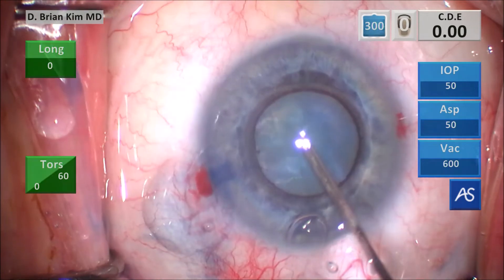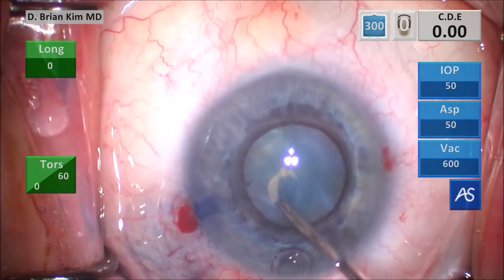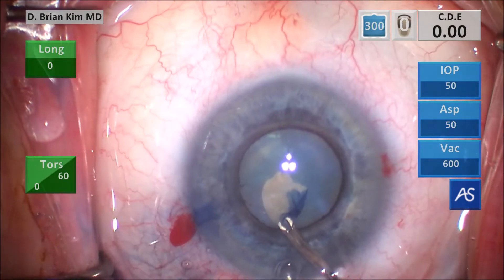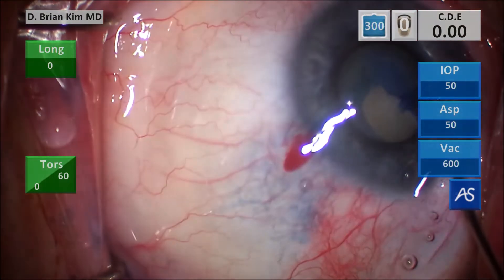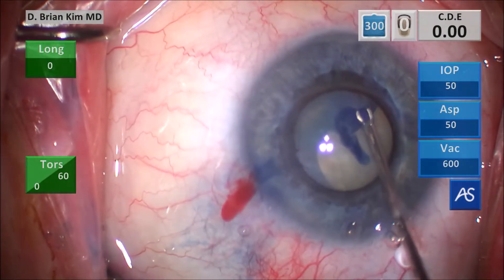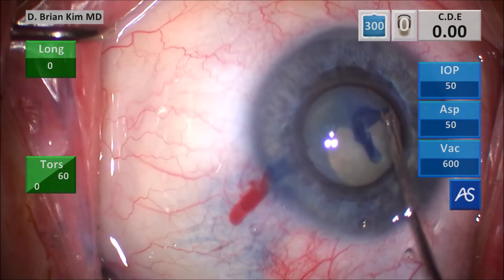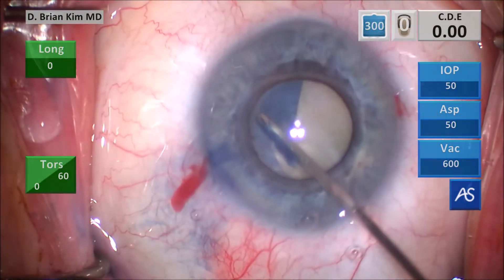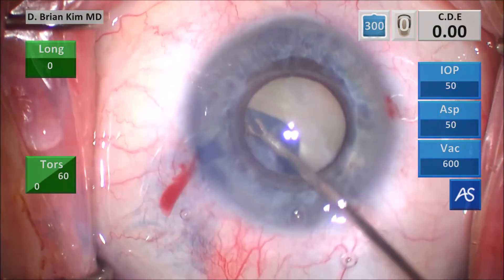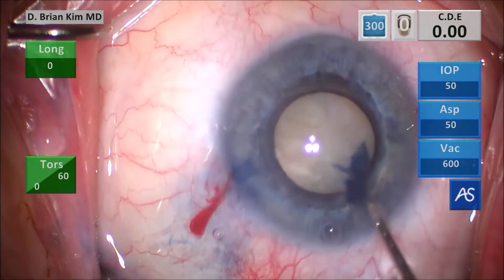This is rather nice — it's got a nice sharp tip. I'm able to puncture the center and use that sharp tip like a cystotome, pulling on the right side of the tear to create a flap. Because I was able to visco-dilate the pupil, the corneal mark I made simulates about the same size as the pupil in this case, so I'll make the rhexis about the size of the pupil. I finish off the rhexis and burp some viscoelastic out.